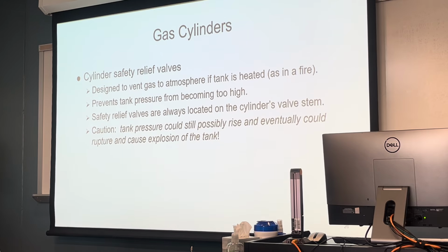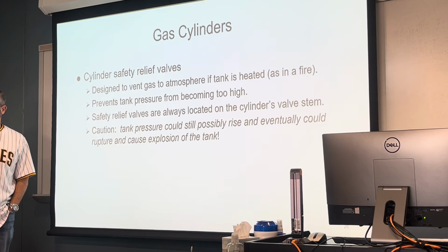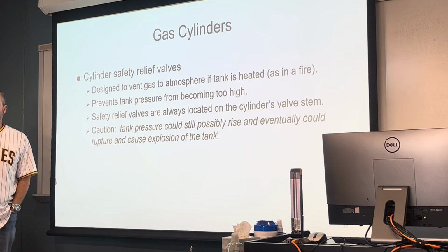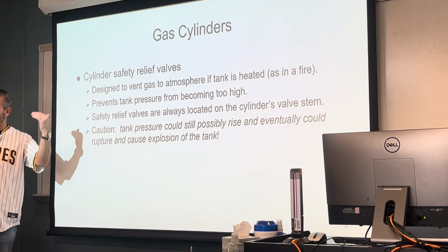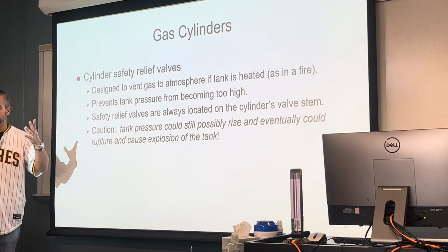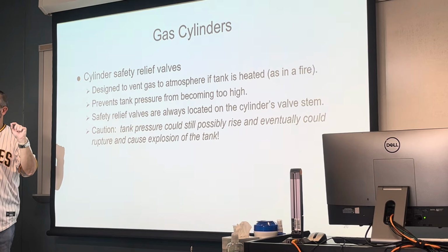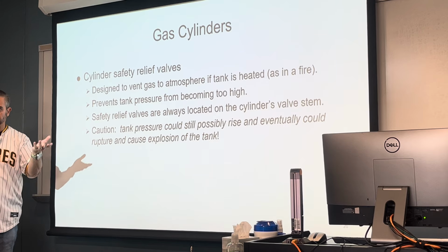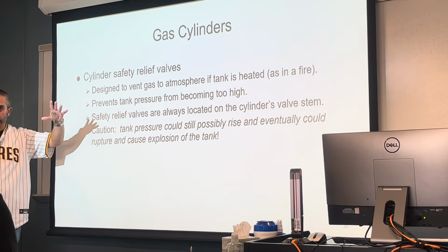All right, every cylinder does have some sort of safety release valve, allowing some of that gas to vent out if the temperature was to get too high. Again, the higher the temperature, the higher the pressure. And these tanks are under pressure, and too much pressure could potentially cause the tank to rupture, explode. Now, these relief valves are to hopefully try to prevent that from happening. If the temperature was to rise, some of that gas can be vented out.